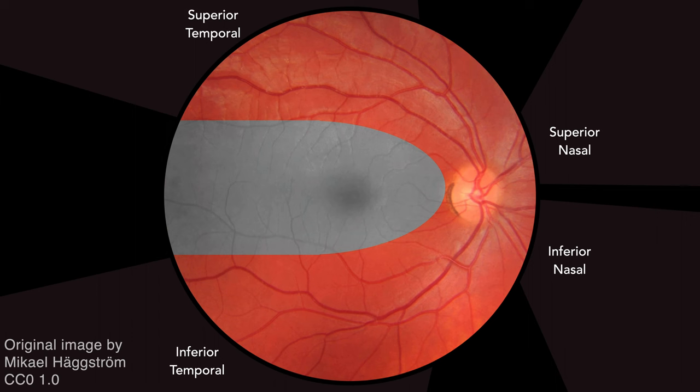Now we will focus on the blood vessels of the retina. The central retinal artery and vein diverge from the optic disc in four branches: superior temporal, inferior temporal, superior nasal, and inferior nasal. The arterioles are lighter colored and more narrow than the venules. Vessel indentation is not normally present where arterioles and venules cross.